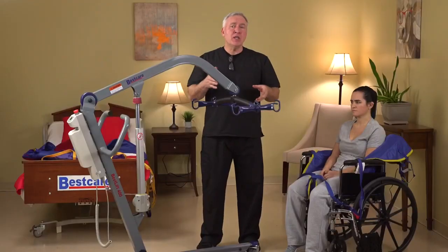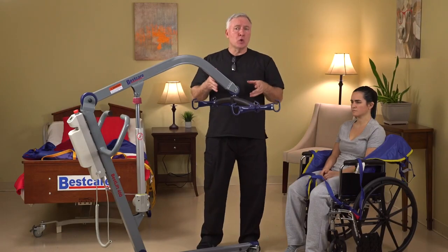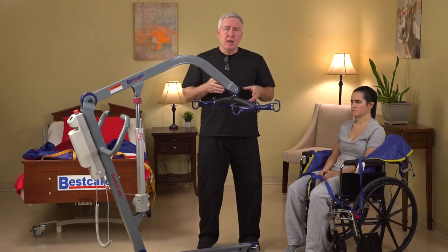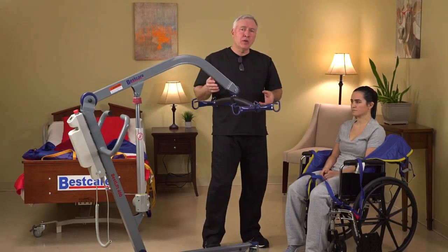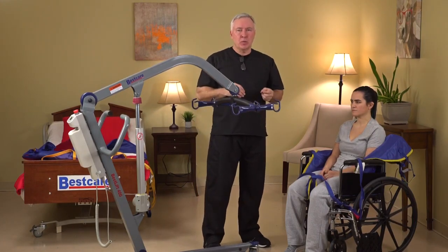This is going to make it much easier for you to understand how to connect the sling to the lift and also control the range and positioning of the patient. But before I get into the actual demonstration of the lift, let me show you how the most 3 common slings are going to connect to this new 6-point spreader bar.